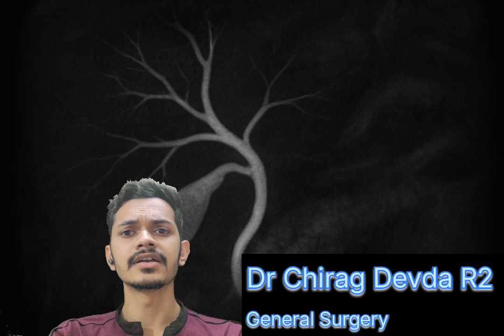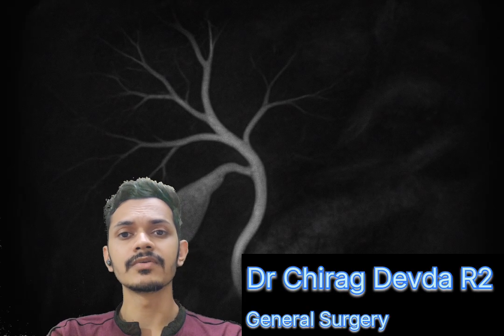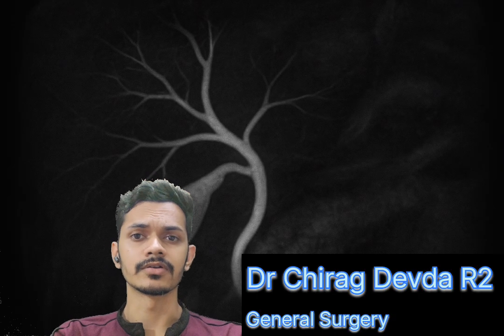In this, we can see the intrahepatic bile ducts, right and left hepatic duct, common hepatic duct, gallbladder and cystic duct, common bile duct, pancreatic duct, main and accessory pancreatic duct, and ampulla of Vater.